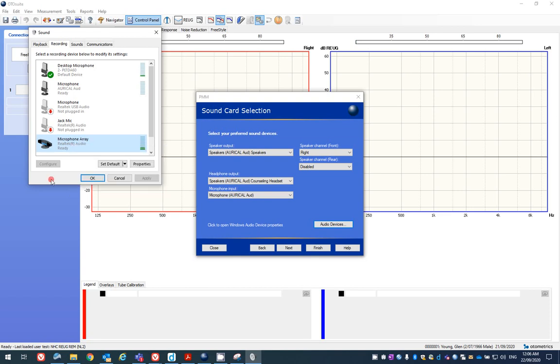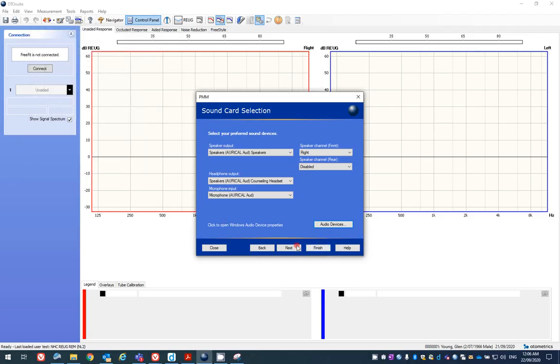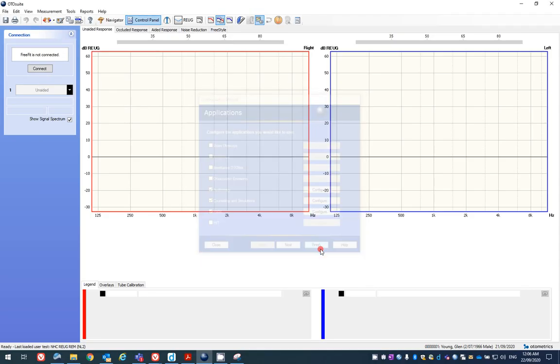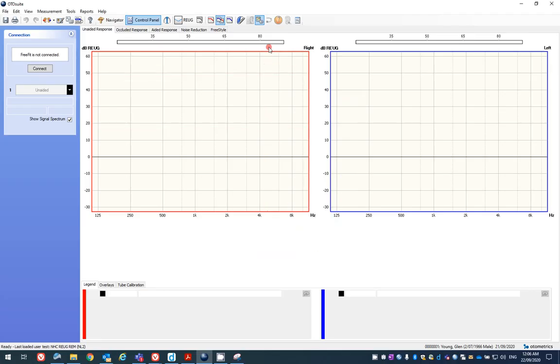That frees up the Aurical. That makes sure that Windows is not going to try and play any sounds through the Aurical or try and use the Aurical microphone. We can say OK there. We can then finish here because we know these settings are correct. And we can finish again. And now if we test, first we'll connect back to that Freefit.